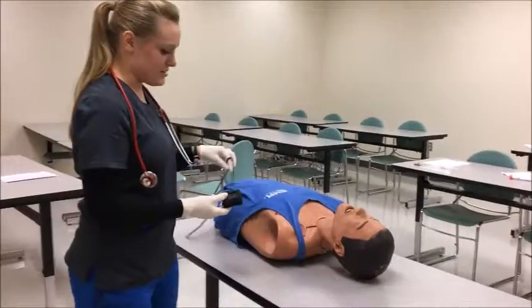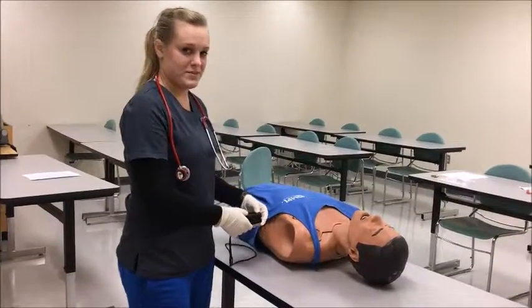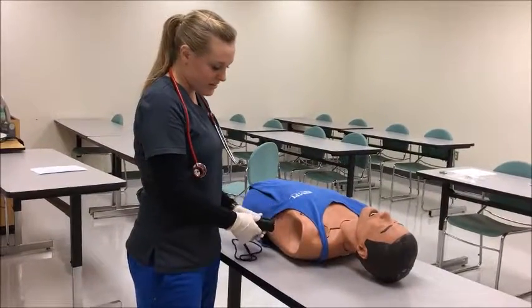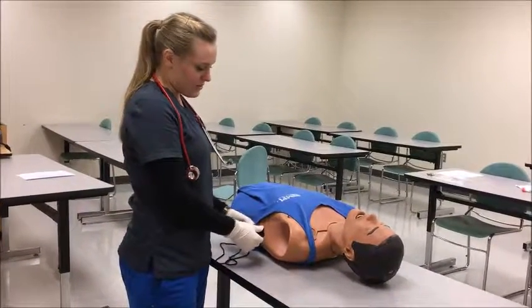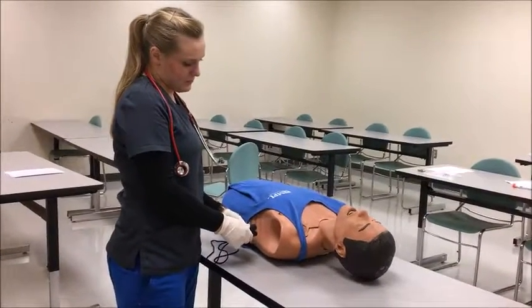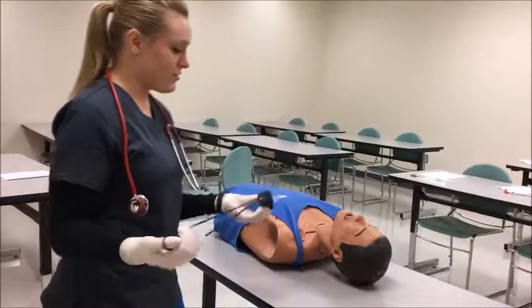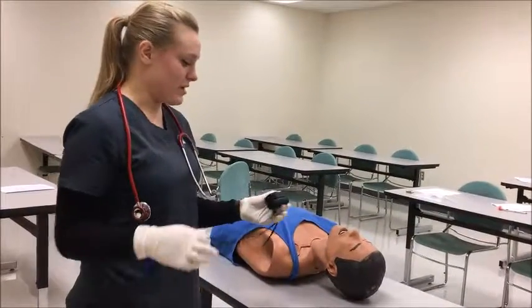You would place this on his finger. For the purpose of this video, I'm going to act like I'm putting it on his finger. You would hold it on for a minute. Okay, Mr. Smith, your oxygen is at 83. And we'll be applying your nasal cannula.